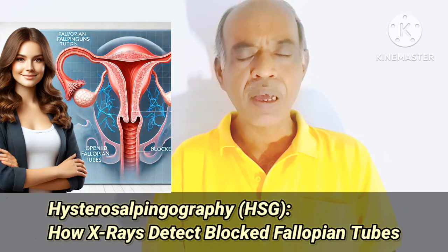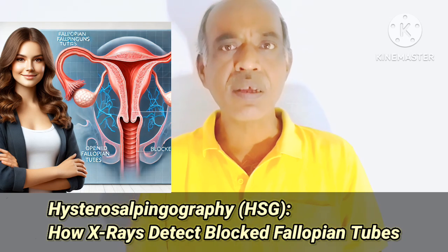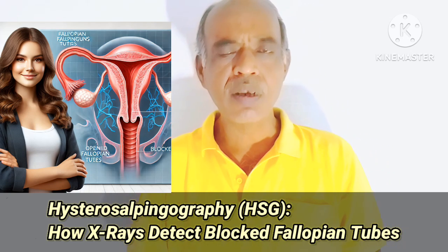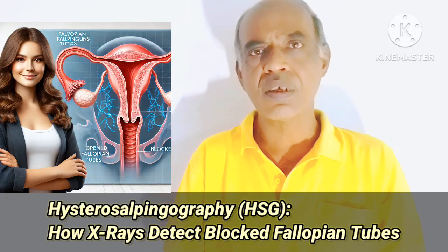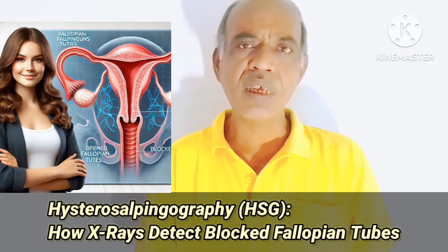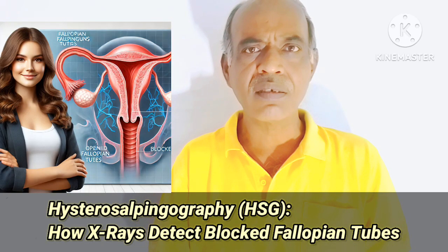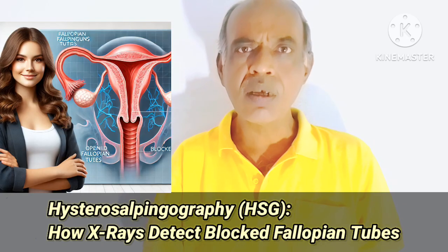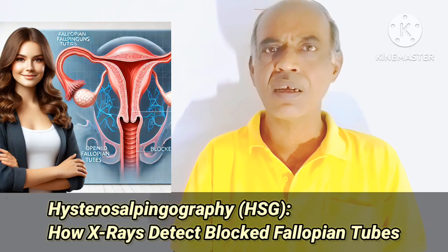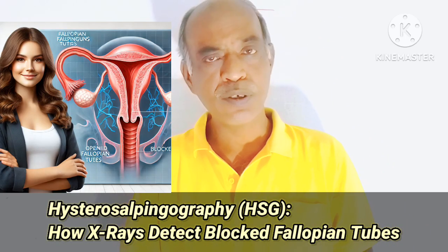That means maybe the fallopian tubes are actually open, but due to involuntary muscle spasms, the doctor may diagnose wrongly and see blockages, because when spasms occur, the dye cannot pass through the fallopian tubes.